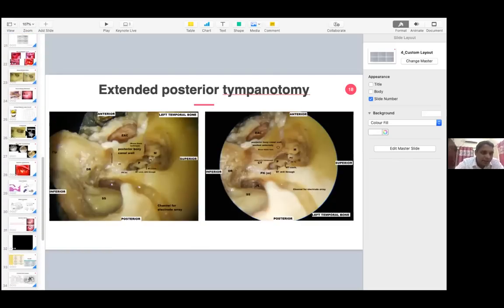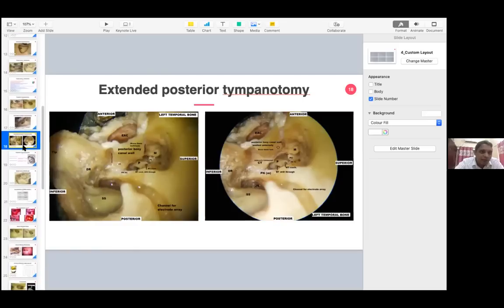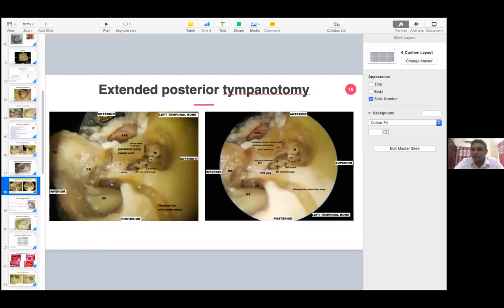A simple thing is, first you see the coronal section. So if you have a cochlear spiral like that, the round window membrane area, if it is a small hitch-like thing like that, then that is a prominent crista. You just follow the round window membrane inferiorly. In a coronal section where you see a cochlear spiral, that will indicate whether the crista is prominent or not.